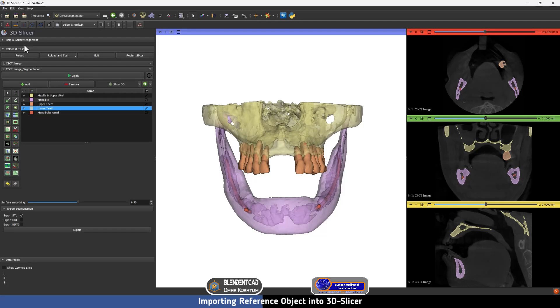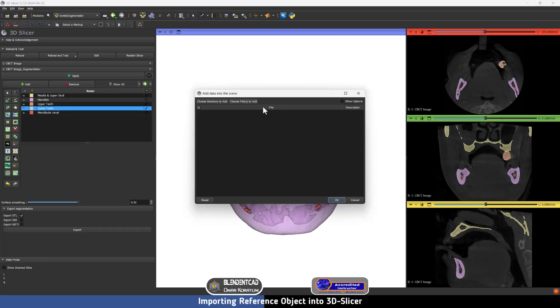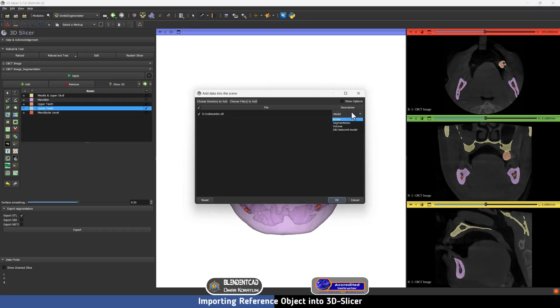In order to check this, we are going to Data and then choose the STL that we created in Blender for Dental by pressing Choose File to Add. After selecting the STL, we are going to import it as a Model — not as a segmentation — and then press OK.